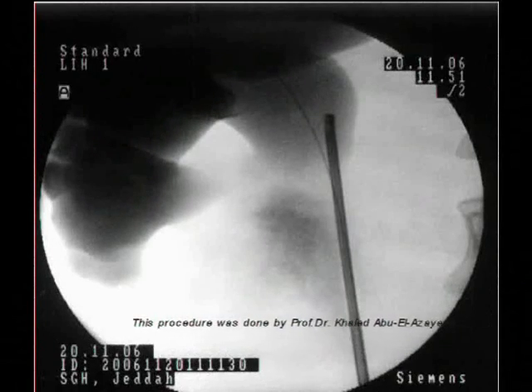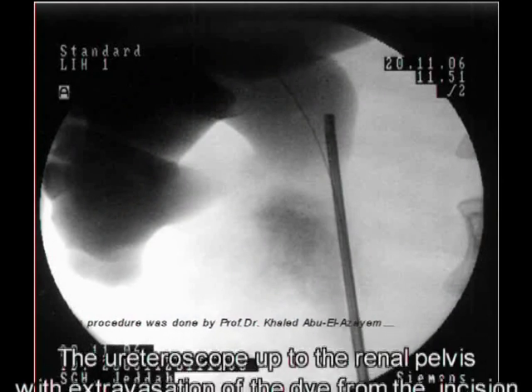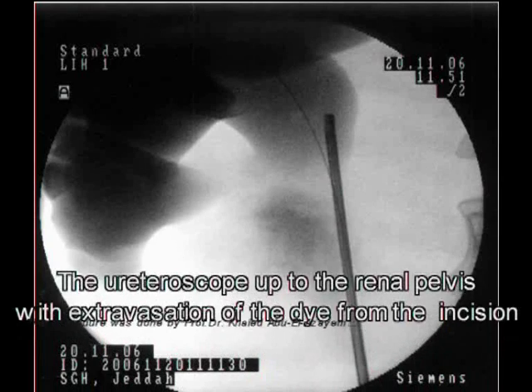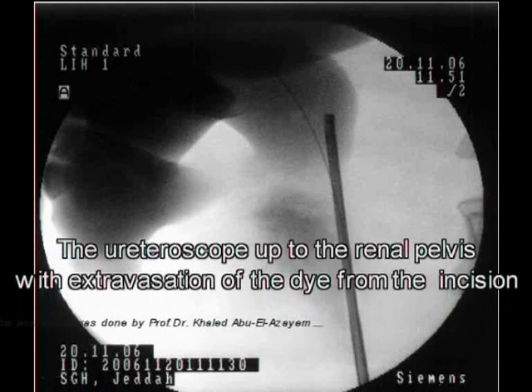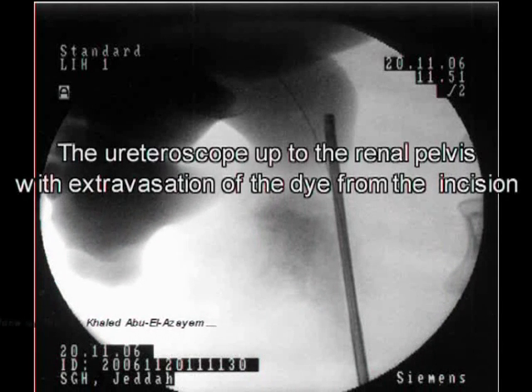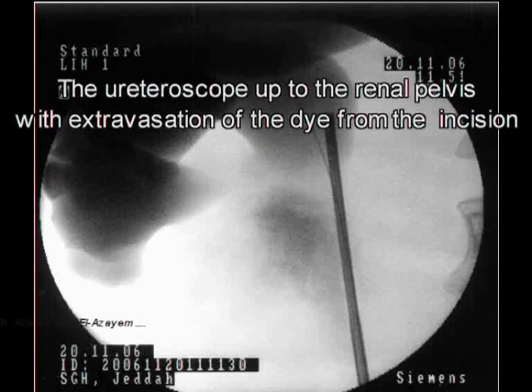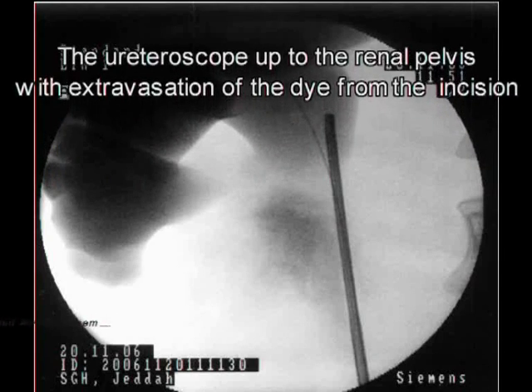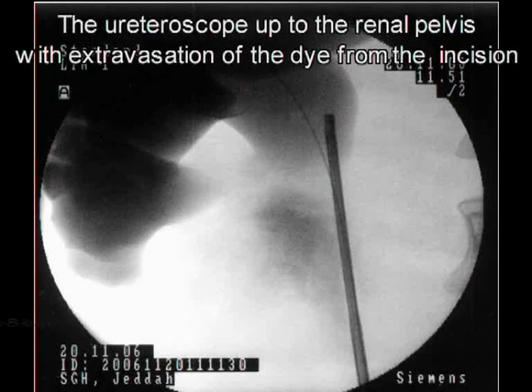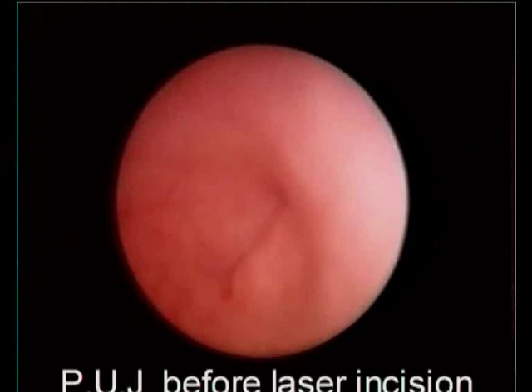This is the ureteroscope up to the renal pelvis with extravasation of dye from the incision. This extravasation is a very important sign of success for your laser incision.